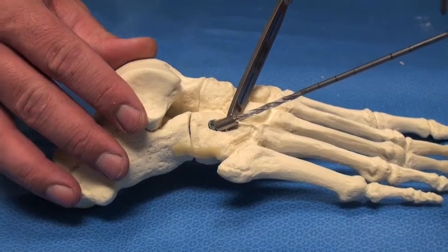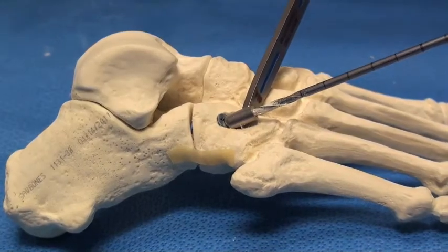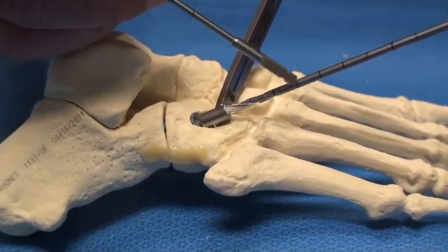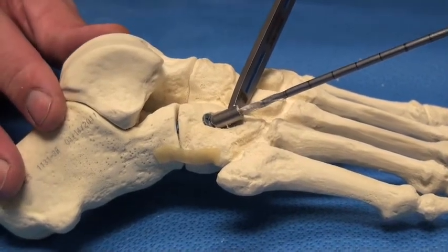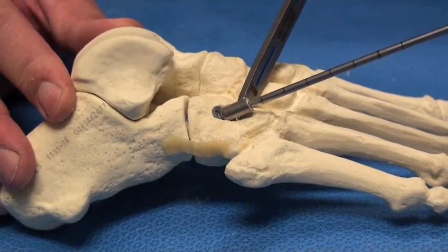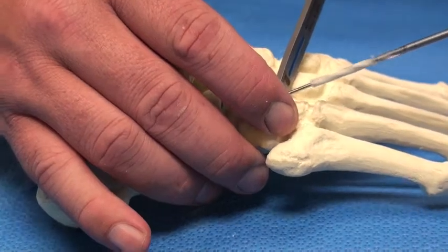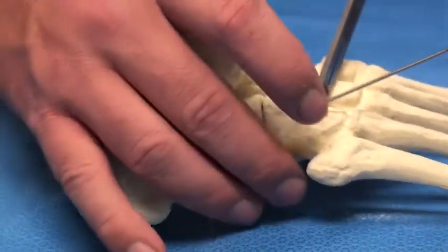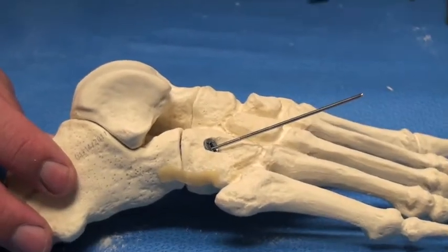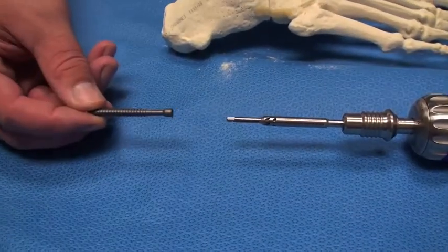Here we're showing the drill guides along with the laser etched lines on the drill. Each laser marking represents 10 millimeters, allowing incremental depth measurement in 10 millimeter intervals up to the desired depth.